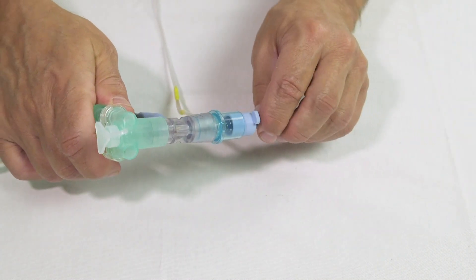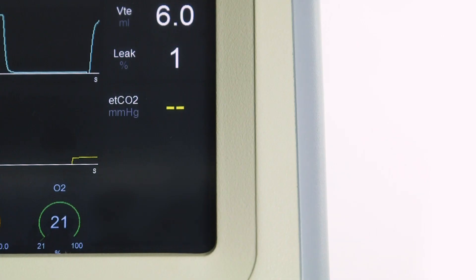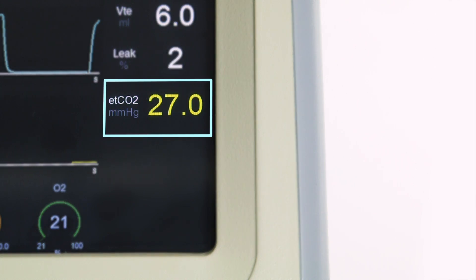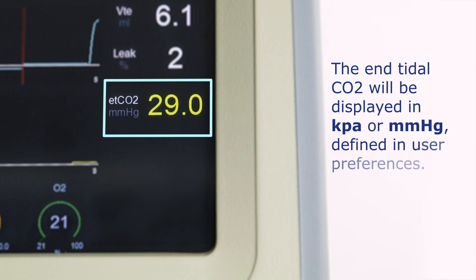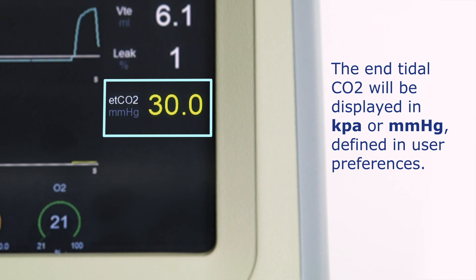Once the sample line is connected, the Micropod will start to search for breaths. When valid breaths have been detected, the end tidal CO2 value will be displayed on the ventilator in kilopascals or millimeters of mercury, as defined in user preferences.